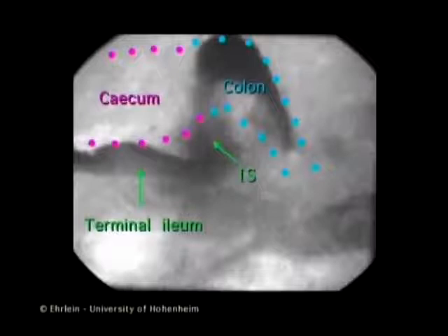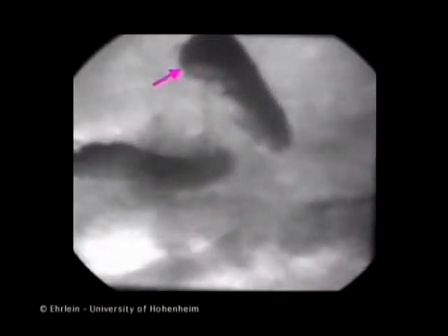The following video clips show giant contractions that produce transport of digesta. Here you see the terminal ileum and the region of the cecum and colon. Contrast medium that was delivered from the ileum into the cecum has accumulated at the cecal base and the colonic flexure. The arrow marks a giant contraction starting at the base of the cecum.